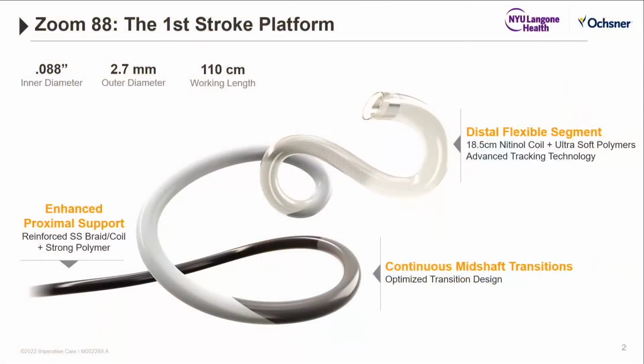Fantastic. And so Eitan, I know you use the Zoom 88. So why don't you take us through that and tell us about what you've had experience with? Yeah, sure. Thank you for the question. So first of all, let me talk a little about the catheter. This is a 088 inner diameter catheter, 110 centimeter long, and that fits through an 8 French sheath.